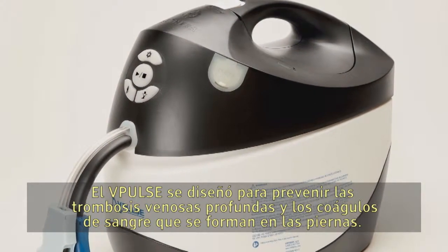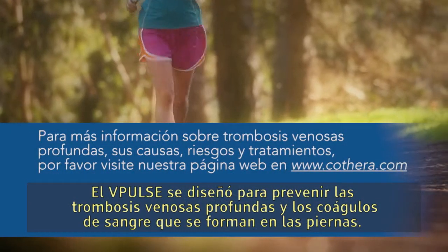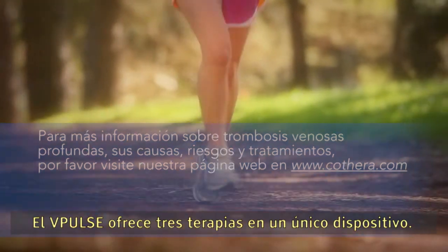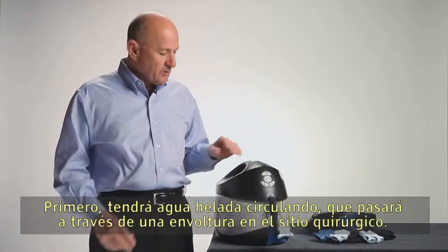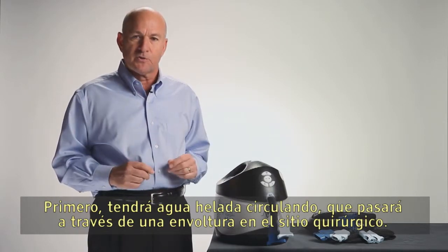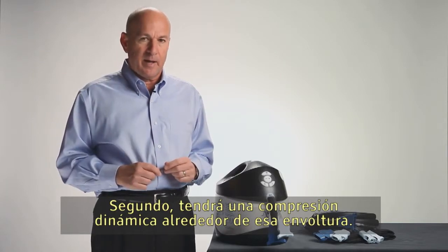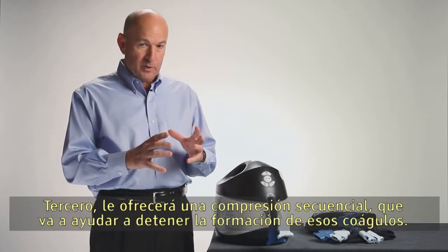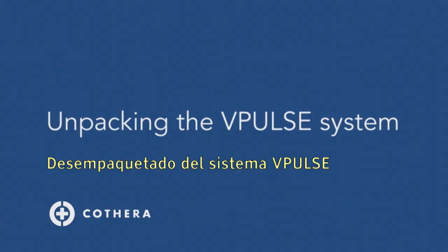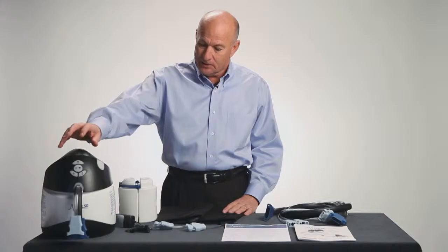The V-Pulse was designed for the prevention of deep vein thrombosis — that's blood clots forming in your leg. The V-Pulse system is really three therapies in one device: first, circulating ice water going through a wrap at the surgical site; second, dynamic compression around that wrap; third, sequential compression that's going to help stop the formation of those clots.